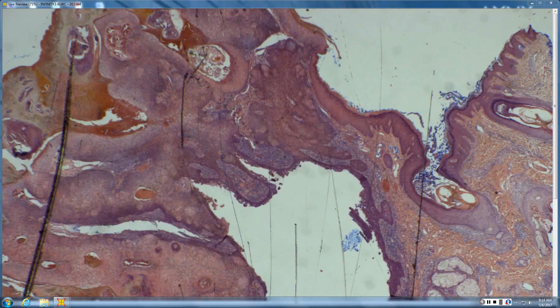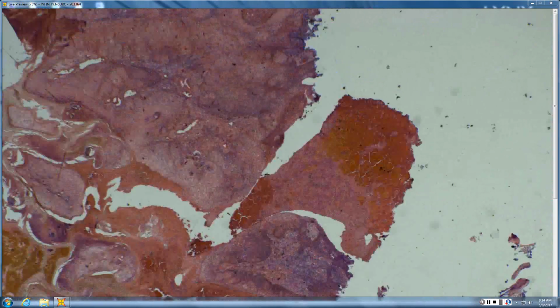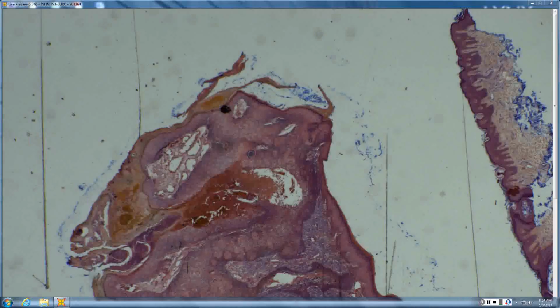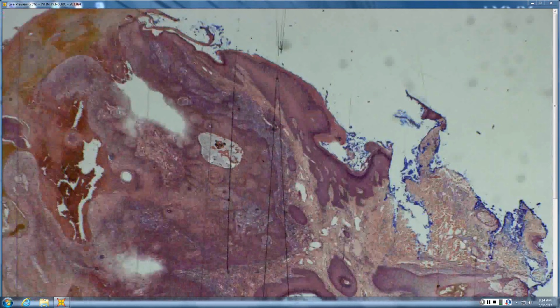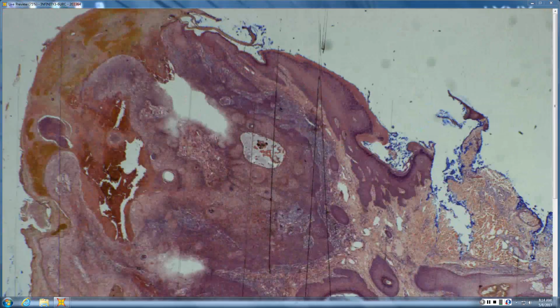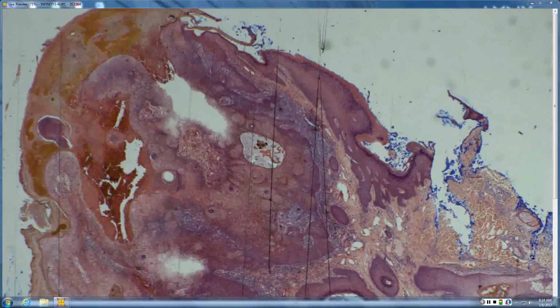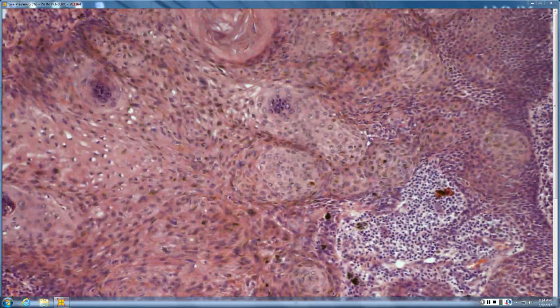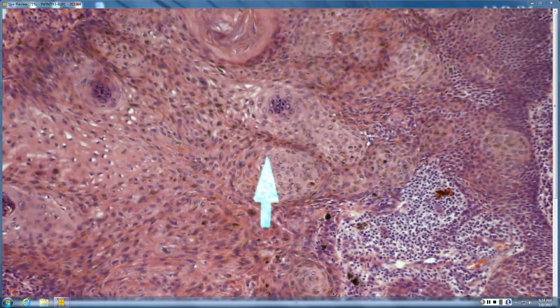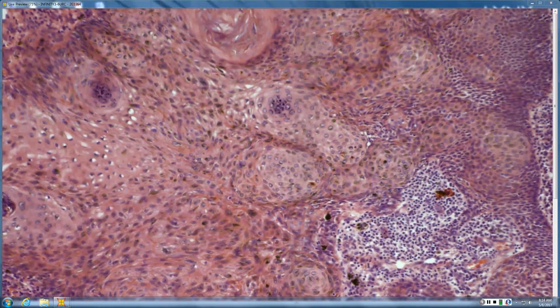So there's hemorrhage in the stratum corneum. Looking a little bit from this height, definitely this is a papillomatous lesion, right? A lot of hemosiderin and atypia. So I'd probably call this squamous. Are you just showing me that it's an irritated seb K? So that's the question. Is it just an inflamed, irritated seb K?